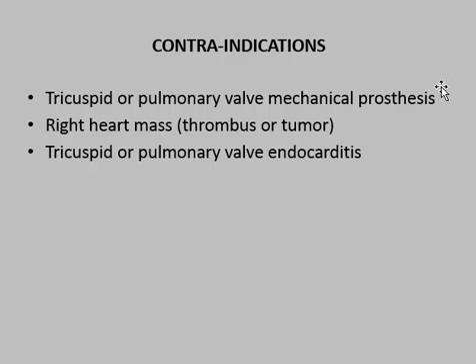Contraindications: I think these should be intuitively obvious. Tricuspid or pulmonary valve mechanical prostheses don't take kindly to catheters that can get lodged because the valves are moving, and if the catheter gets jammed in there, the valve stops functioning correctly.